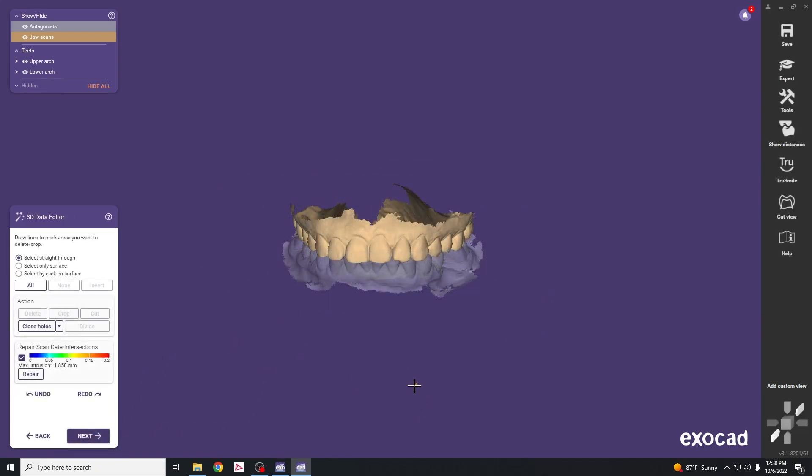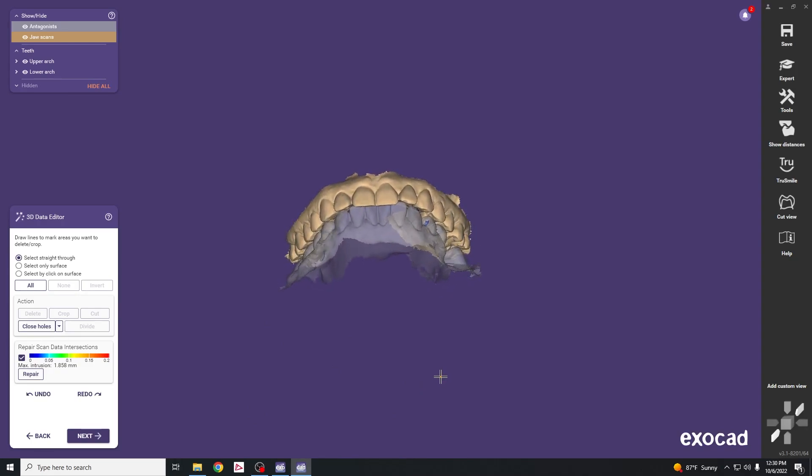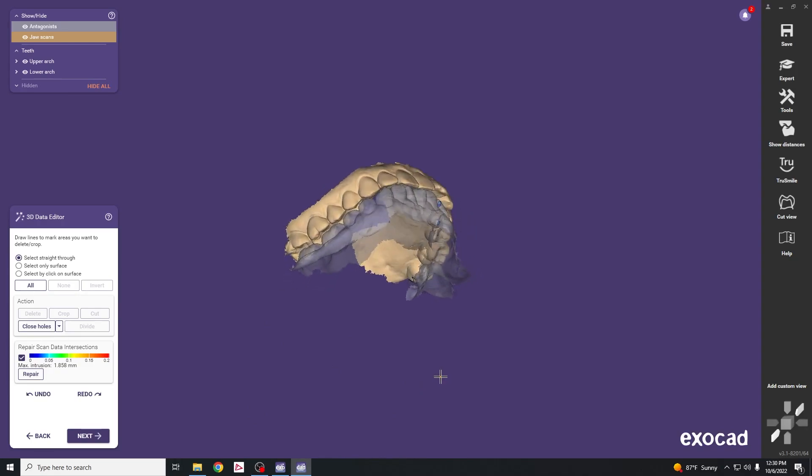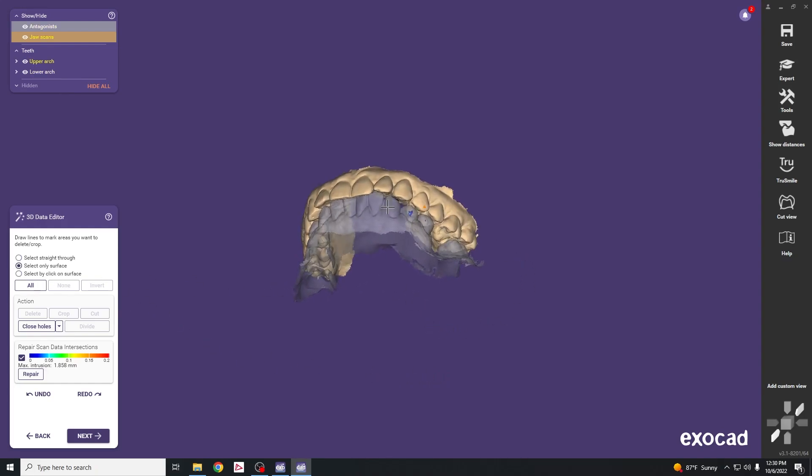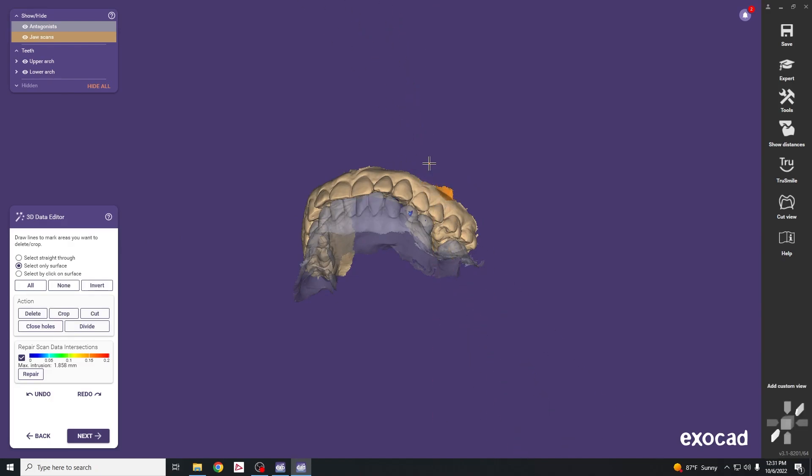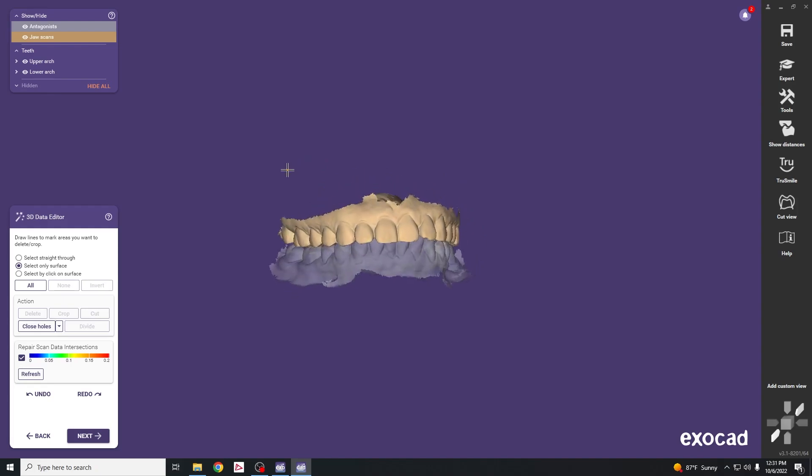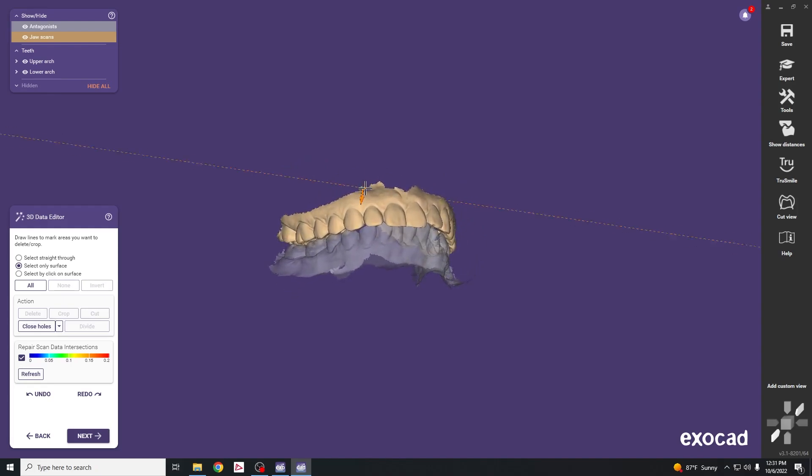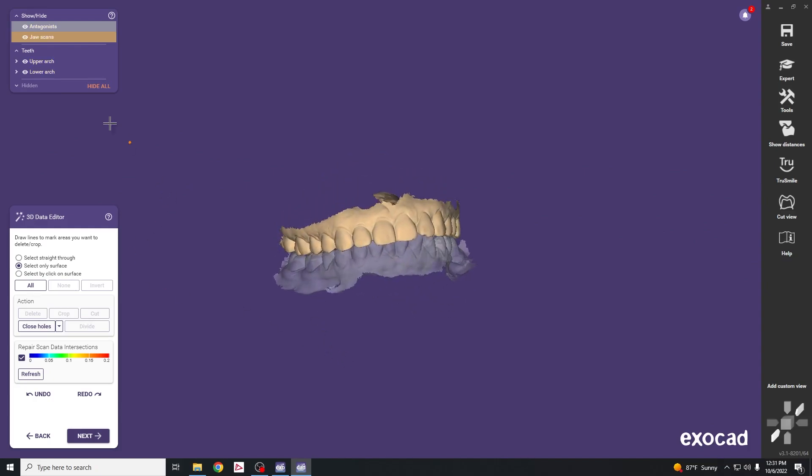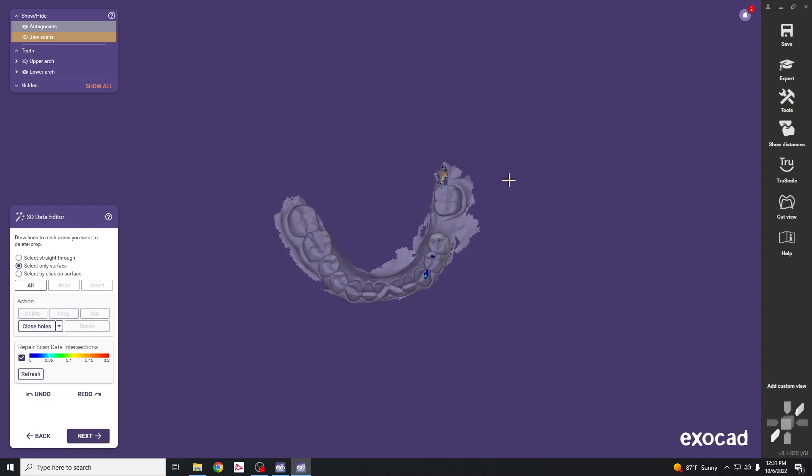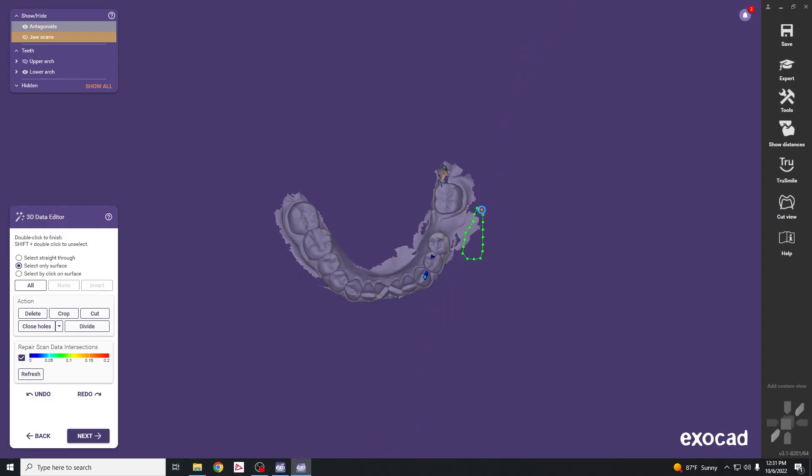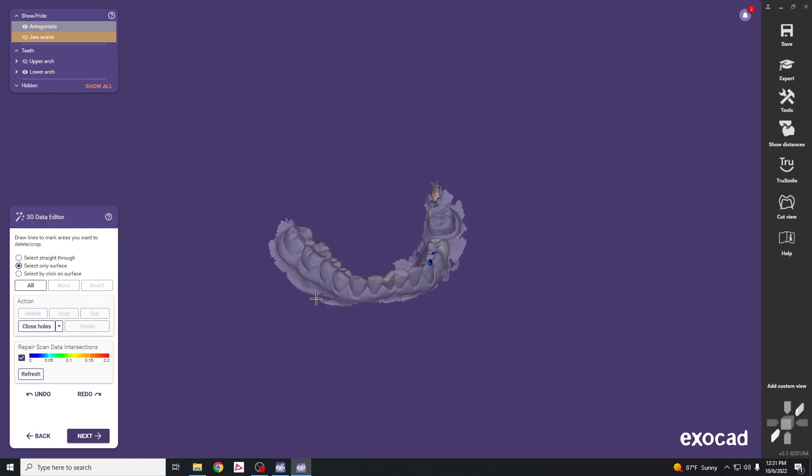This next step is to clean up our models. If we have any bad data or islands or uneven edges we can start to trim those. Select the select only tool. Left click and drag, circle any areas that need to be cleaned up, double click to close the loop, then hit delete to take out unwanted areas. Turn off the upper one so we can see the lower better and get some smooth edges.